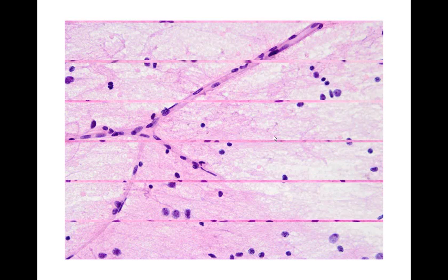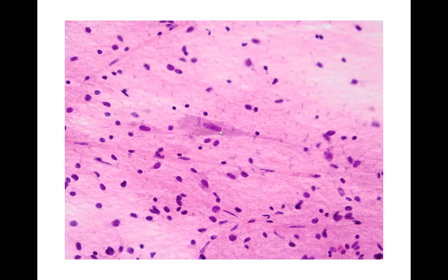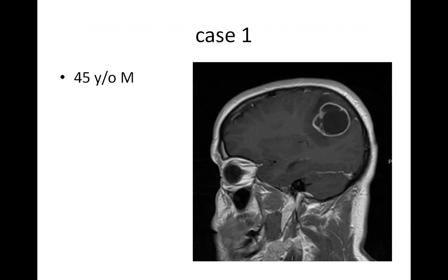Now, if you smear gray matter, this is what normal gray matter looks like with neurons. These big guys here and here, those are neurons. That's what they look like on screen. So burn those images into your head because you're going to start to see a lot of really abnormal stuff.